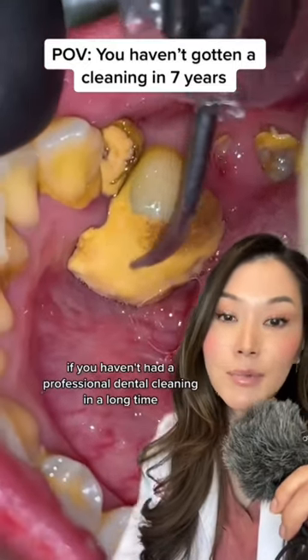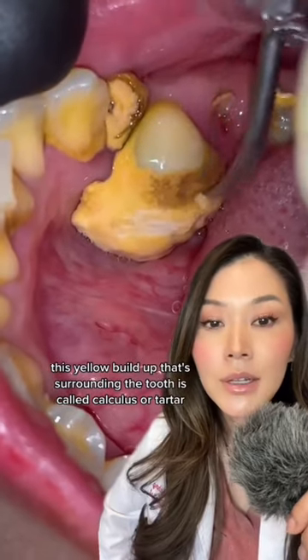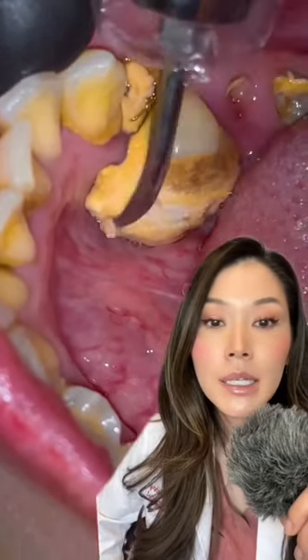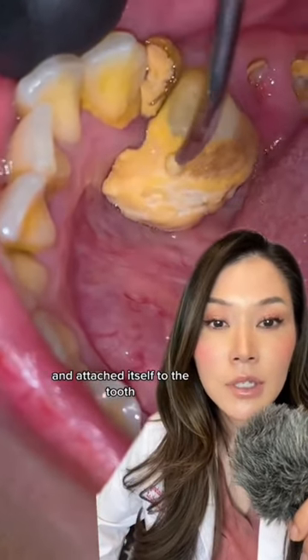This is what can happen if you haven't had a professional dental cleaning in a long time. This yellow buildup surrounding the tooth is called calculus or tartar — it's basically soft plaque that has hardened through the minerals in the saliva and attached itself to the tooth.